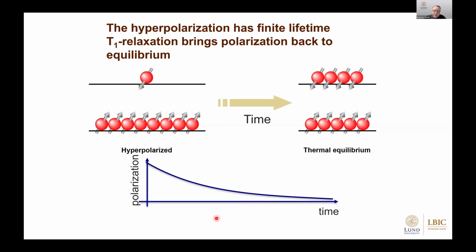So it will not help you a lot. It will work in a lab with a vertical system, but if you want to use this as a contrast agent in human use, the time it takes from the injection site to the organ of interest, without even considering any metabolism, is already way longer than the half-life of this component.